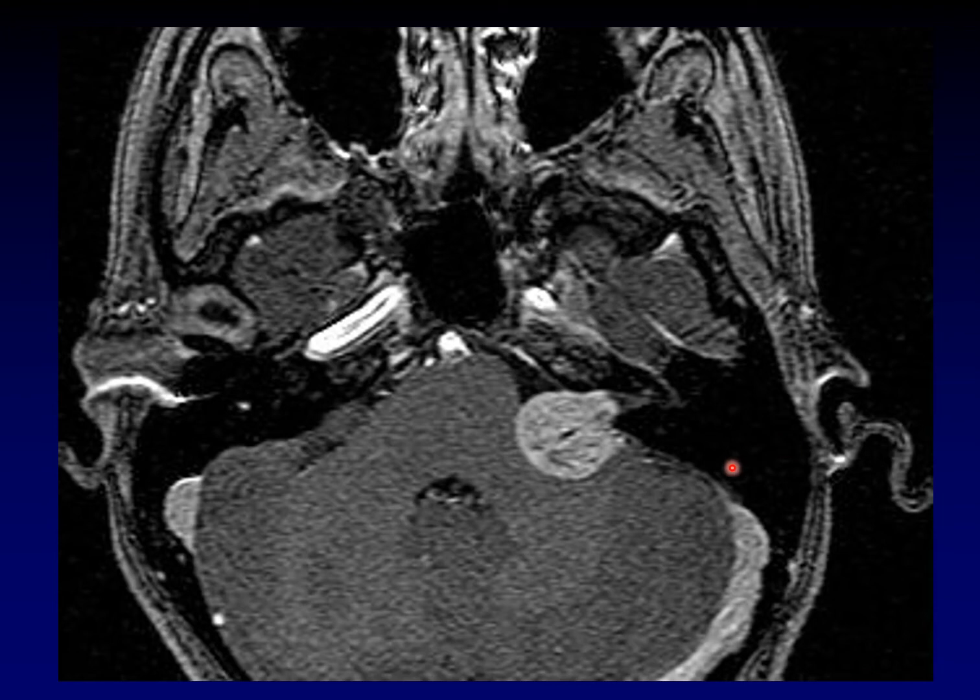Here's a situation where we have a mass that's centered on the porus acusticus, widening the porus acusticus, knuckling a little bit into the IAC, and it's got more or less homogeneous enhancement, with some heterogeneity to it. Notice how on this side it makes a sharp, acute angle with the underlying bone, and over here an obtuse angle with the underlying bone. Well, now you've got two conflicting sets of findings here. But overall, this is the trustworthy angle, that knuckle in there. Taking it all together, this looks a lot more like a vestibular schwannoma. So you end up looking at the different features and balancing them all out in your mind.